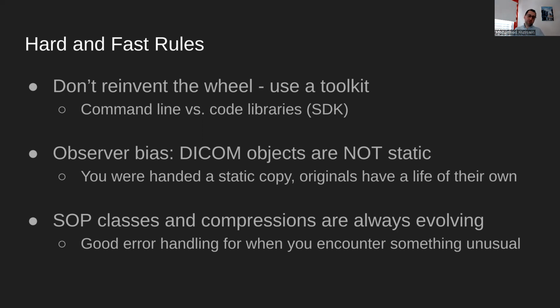Sometimes you get a patient that's admitted into the ER with, let's say, car accident trauma, so they actually have no idea who that patient is. They're entered as Jane Doe, but then they realize down the line that no, that actually was Amanda Wilson, for example. So then all these objects are updated with the new patient demographics. Just because you were given a static copy doesn't mean that the originals haven't moved on past what you see. And of course, remember that the DICOM standard is constantly evolving.